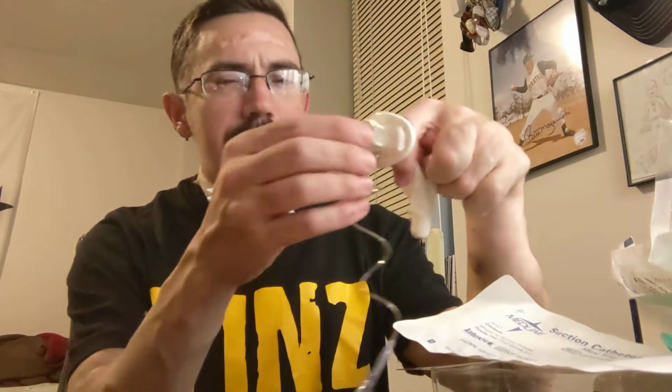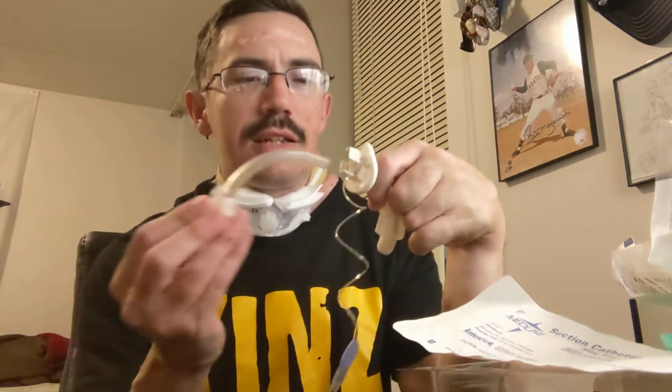If you've followed this channel for a lengthy period of time, you may know that I've had a lot of health issues, and I've talked a lot about those health issues in the past. I think I even did a video once where I showed you how to change your cannula. It was only 20-some seconds long. You take the one cannula out and get rid of it, because it's full of mucus and all sorts of stuff. Take the new one and put it in, which is why it only lasted about 20 seconds.